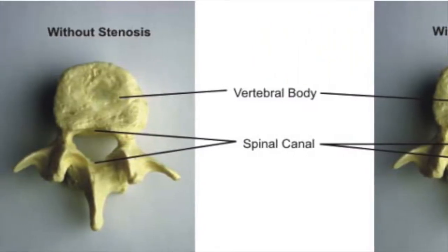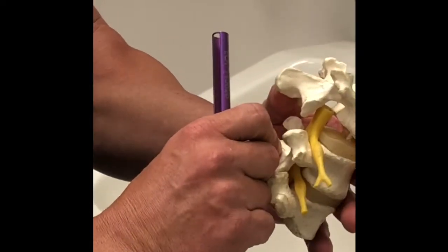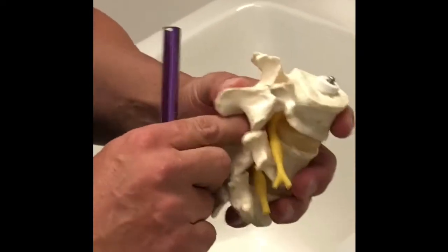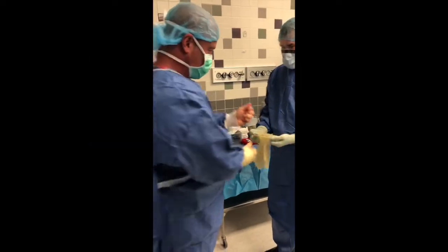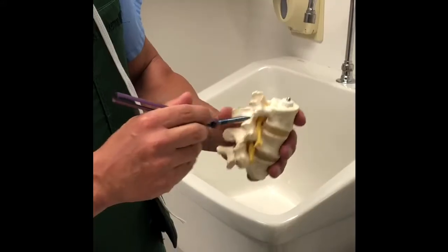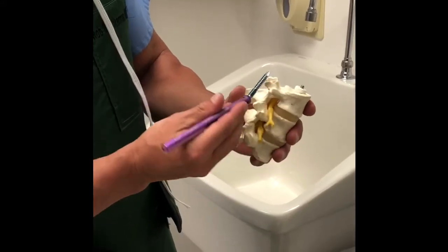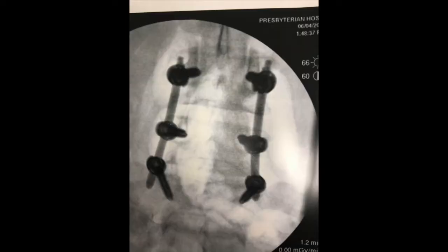So to fix that, we have to take these joints off so I can open him up to give him space. And so when you take the joints off, it would make him unstable. So what we do is we drill the joints off to decompress the nerve, put a screw in this pedicle and a screw in that pedicle, and then connect it with a rod. And that now holds him together. There won't be any bone in the middle. So that's the first case for today.